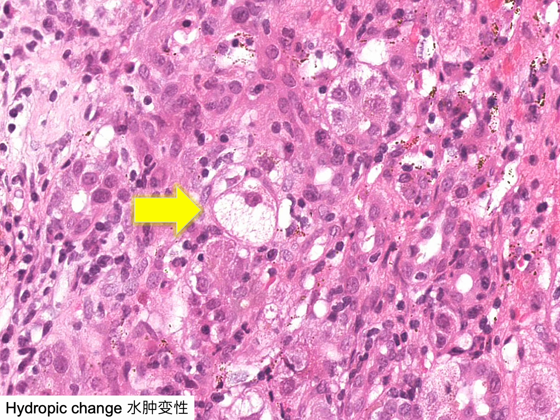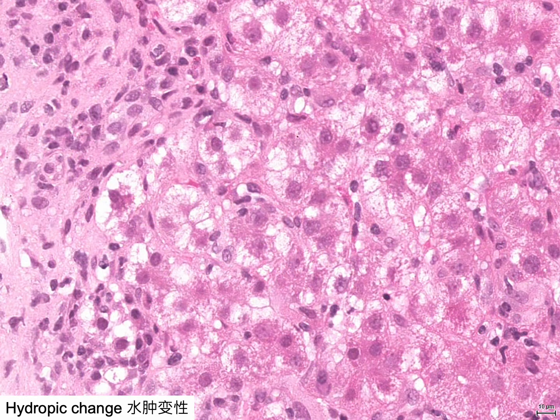This is an example of a hepatocyte with hydropic change in a patient with autoimmune hepatitis. Another example shows hepatocytes with hydropic change in a patient with severe autoimmune hepatitis. Morphologically, these swollen hepatocytes could be sometimes indistinguishable from ballooned hepatocytes.